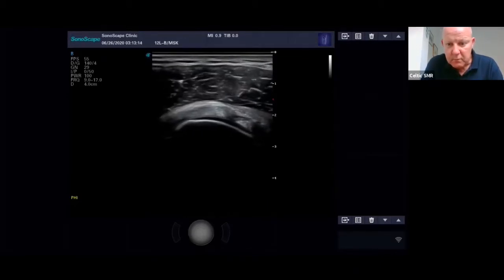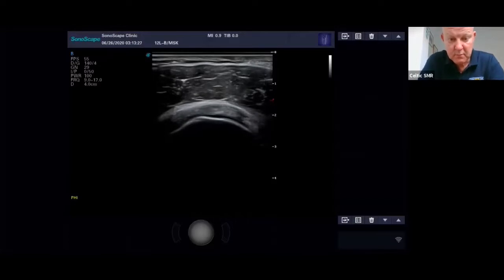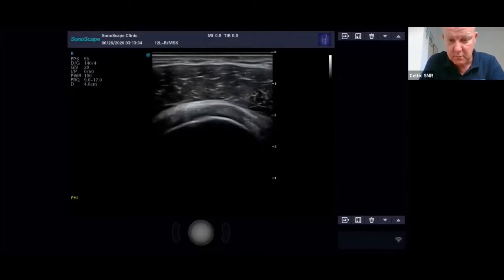Okay, so now I'm going to adjust the screen a little bit here. We're on the 17 megahertz probe, which is the highest frequency. And if you look on the screen to the right, there's a little red triangle. Now, that's your focus. That's where your image is optimized. So I want to move that down a little bit.